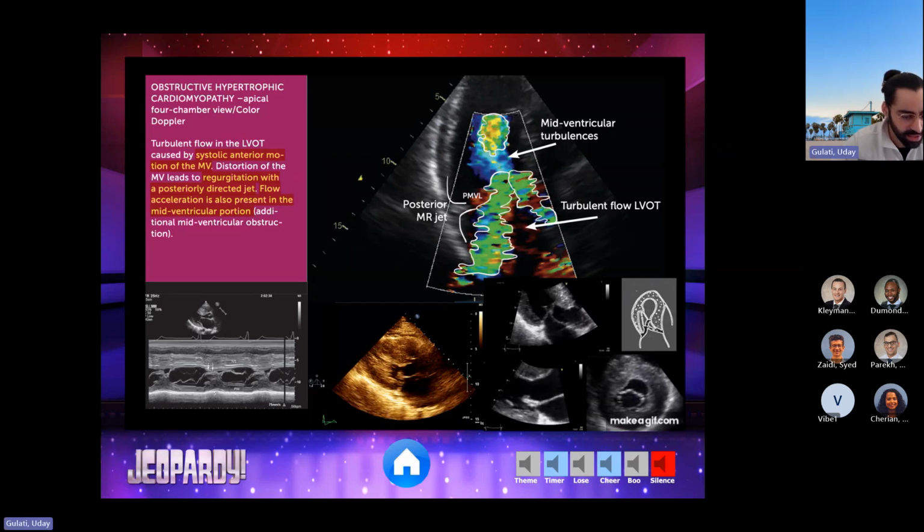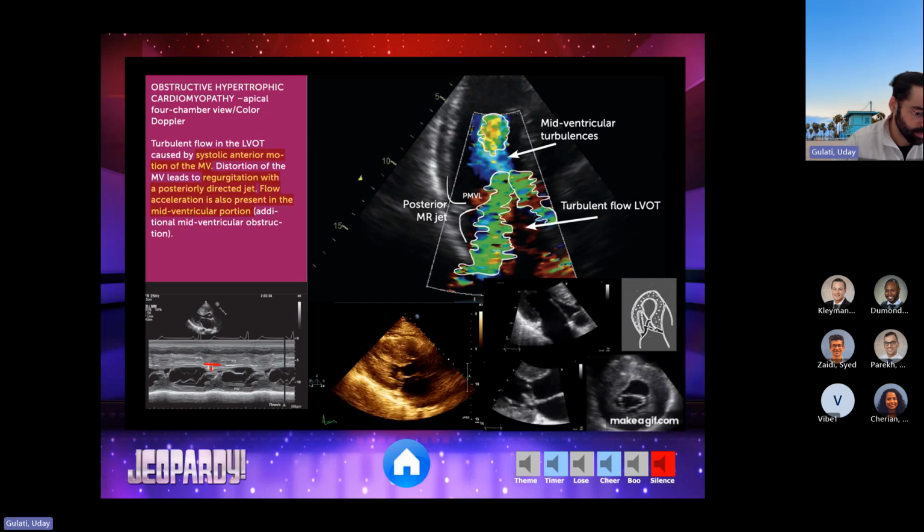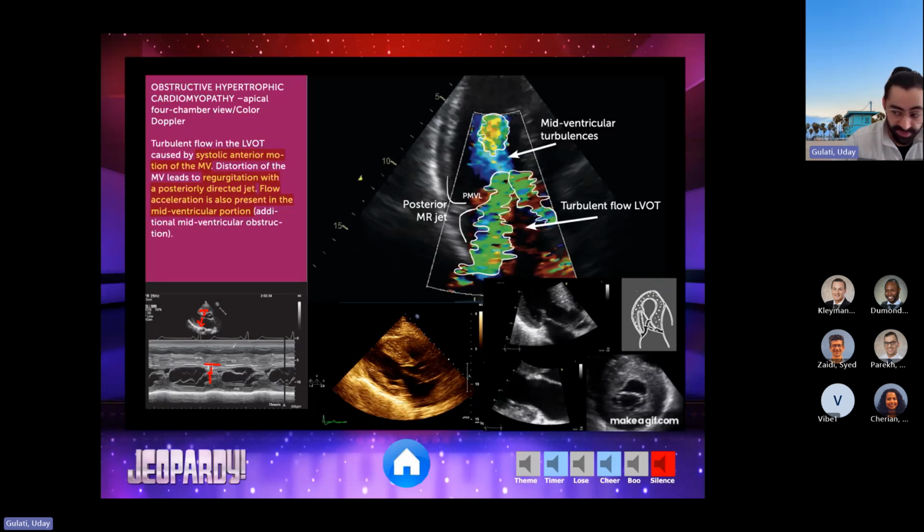So what you're seeing is that here during systole, because there's a lot of high pressure from the left ventricle when it's trying to contract out, the wall actually pushes inside. And then the mitral valve also goes inside instead of closing like it normally should. Normally this mitral valve should go this way. Instead, it's going the other way into the outflow tract because of that negative pressure gradient known as the Venturi effect.